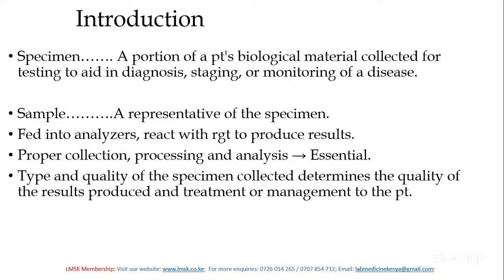You don't process the whole specimen in the laboratory. You just take a portion, which should be a representative of that specimen you've collected. You keep the specimen aside for future use. So whatever you pick from the specimen is a sample, a representative of the specimen.